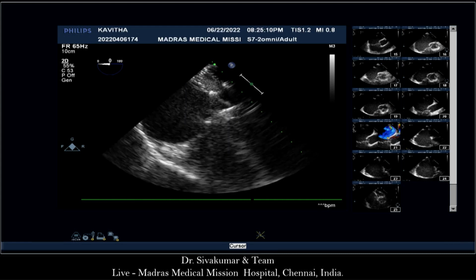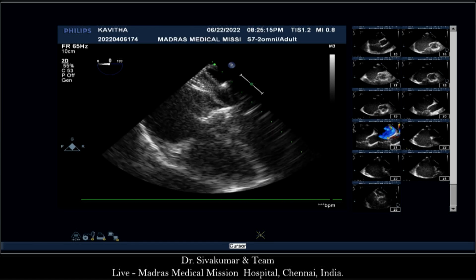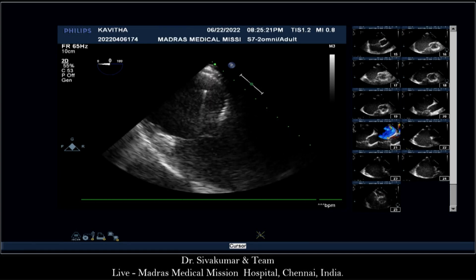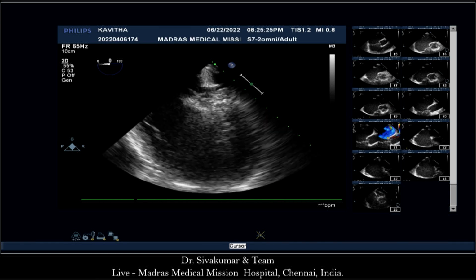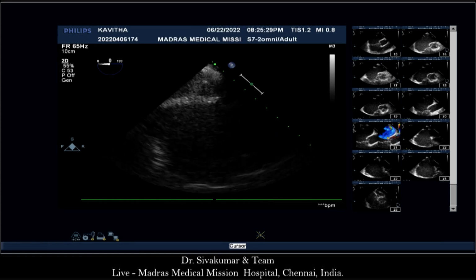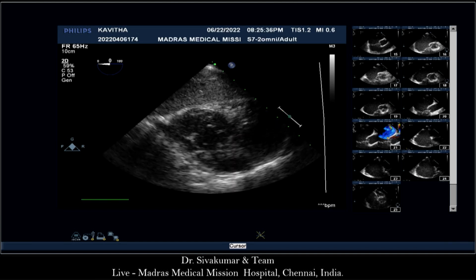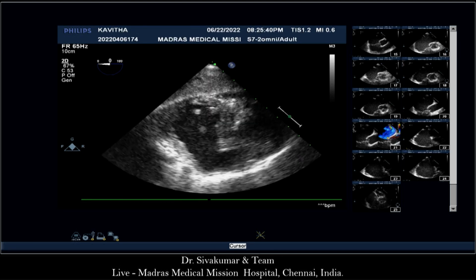Okay, well, can I suggest something? Apical four chamber. So can you go transgastric? Can we do a transthoracic? No, before you do transthoracic, do transgastric and focus on the mitral valve in transgastric. Go further inside, deep inside. Okay, now flex, anti-flex the probe fully. Okay. Now come out on the 0 degree to 90 or something, then you will get the longest.